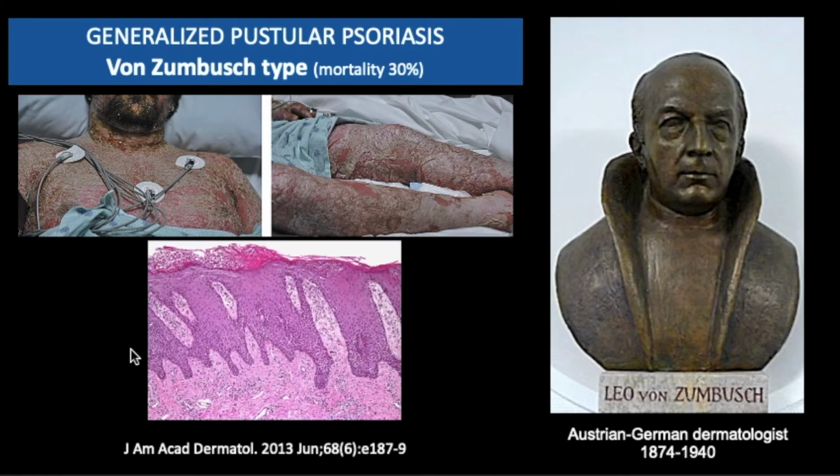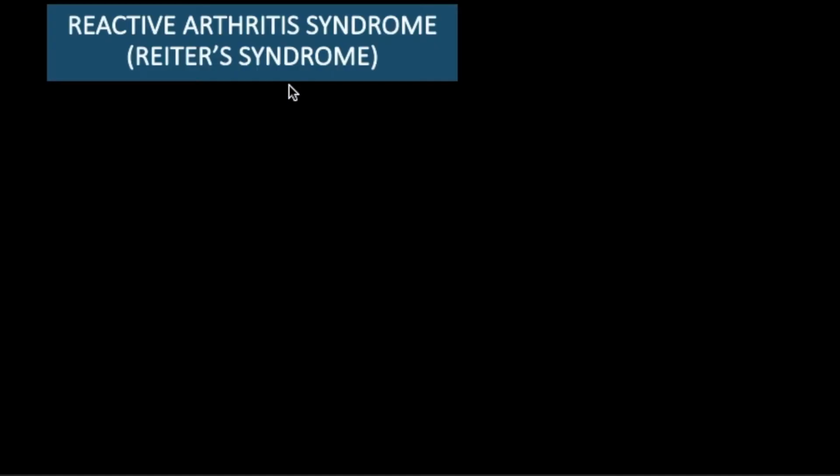Histologically it is usually similar to pustular psoriasis, where we see the pustules and the epidermal hyperplasia along with the dermal vascular proliferation. But the unique clinical picture, as we see here and as the name implies, is generalized in these patients.